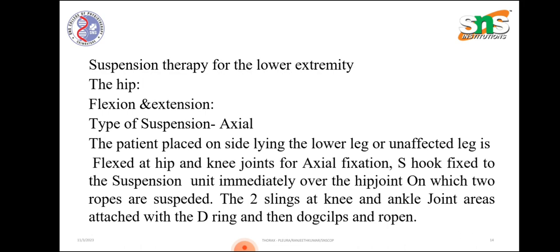Then the moving segment. With this setup, flexion and extension movement is encouraged. In vertical suspension, the fixation is at the center point of the moving segment. One disadvantage is the small range of movement. Then pendular suspension, where the axis is away from the axial suspension, is mainly used for resistance to the moving segment.